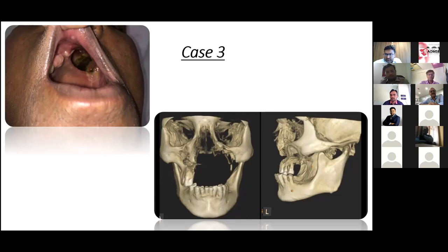If you take the orthopedic literature, there is a huge literature on compression plates, where it works on compressive strength. So if you take the principle from them and implement it in our area, I am still not sure what my results will be. I am still awaiting the 1 year CT scan of this, but till now, 8 months, we had our own problems. We are improvising. We have changed the design. This type of defect, I think we are going to try to close it with the PSI. I am still designing.